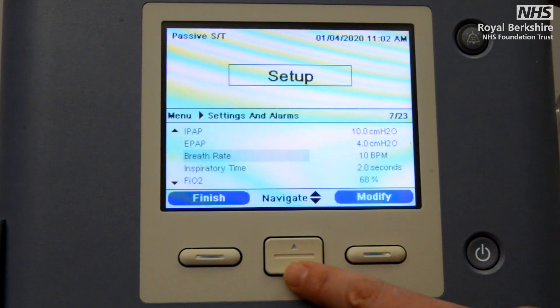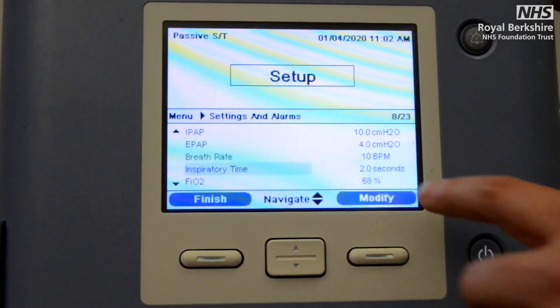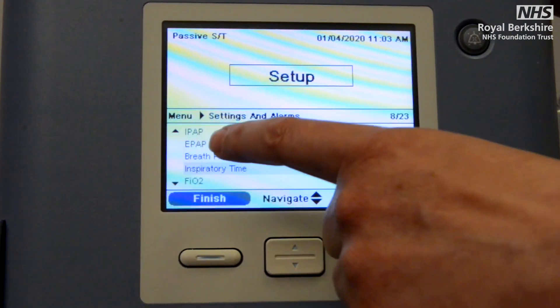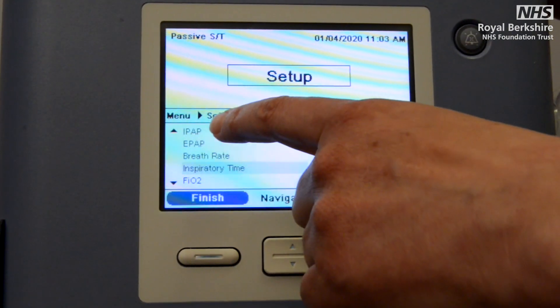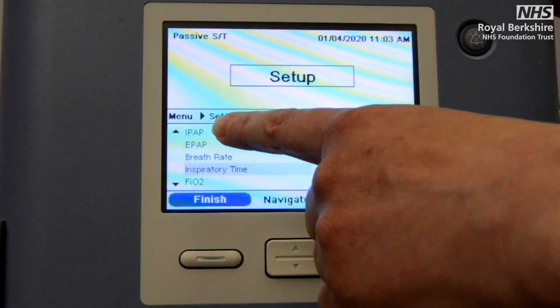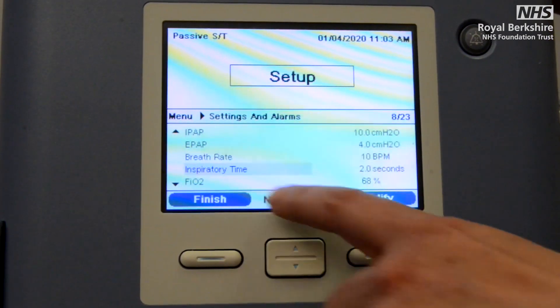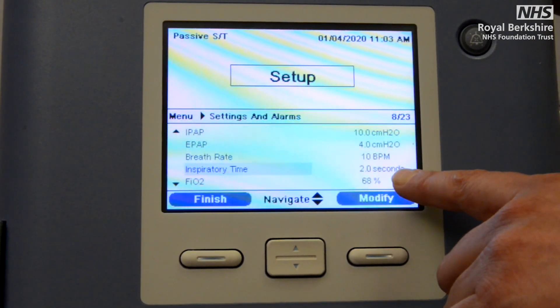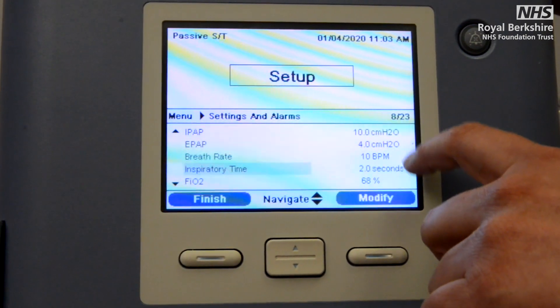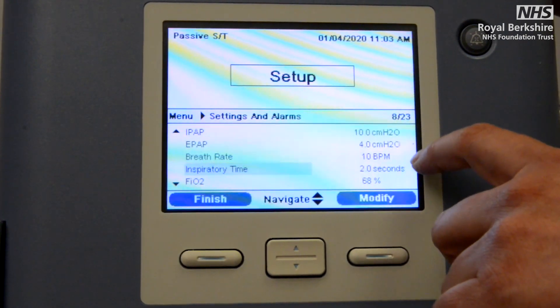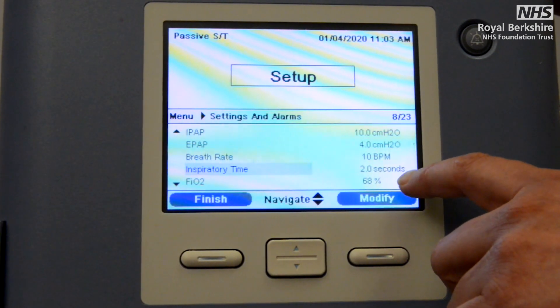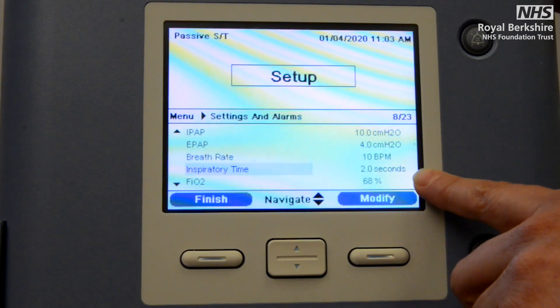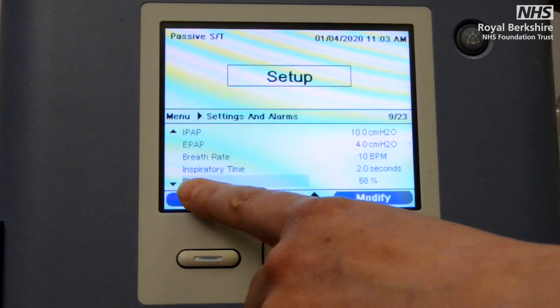The next thing we have is the inspiratory time. This is simply the time that the machine will deliver the difference between your EPAP setting and your IPAP setting — which is known as your pressure support. For most patients, an initial setting of two seconds is exactly where we want to be. This may need to be titrated against your patient's need, but that would be a doctor's or critical care outreach decision.